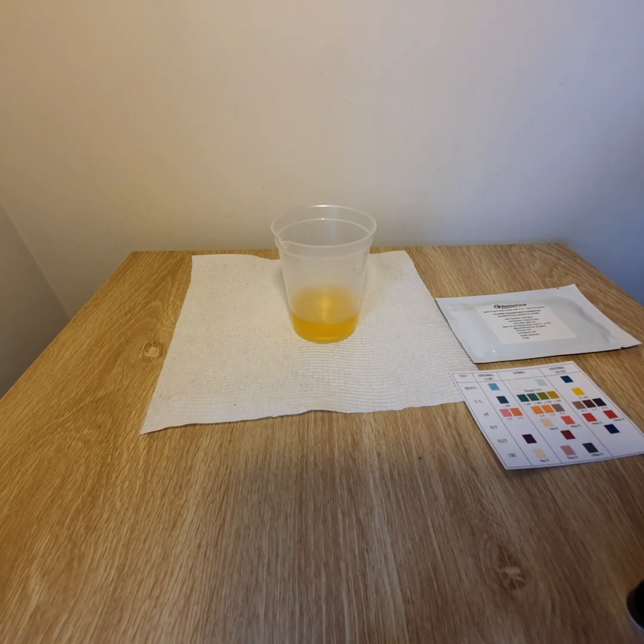Hi everyone, Dave here from Ausdrug Test, here to explain the correct procedure in using the six-panel urine dip card with adulteration test attached.